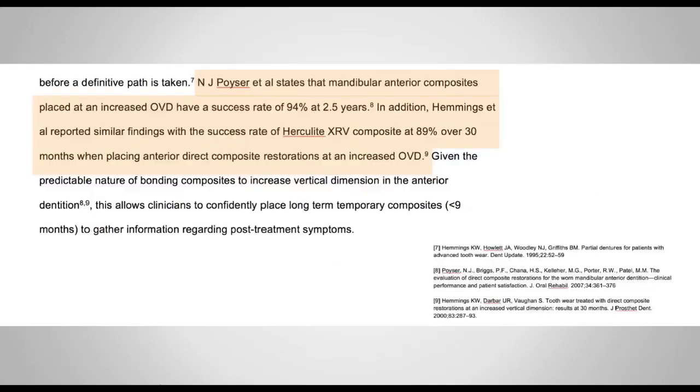So for me, I want to feel more comfortable having a trial period with something that is retrievable, something that I can always remove and put my patient right back at the beginning, exactly the way that she got to my practice. If for whatever reason she doesn't like the numbers, or doesn't like the complexity of the treatment, or he doesn't like the complexity of the treatment, and they just don't want to go into that treatment at this point.